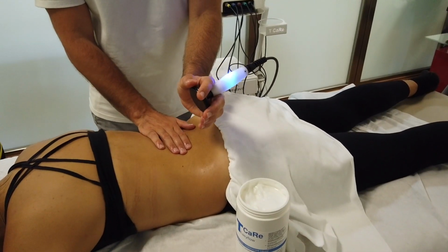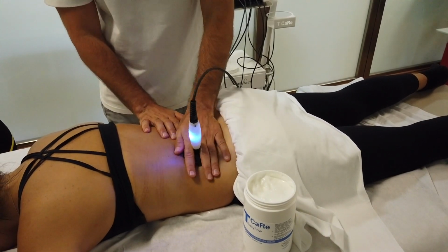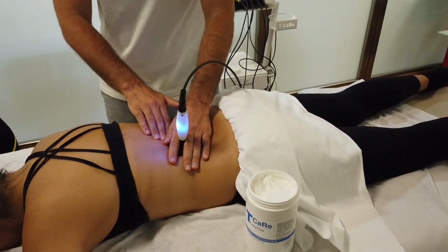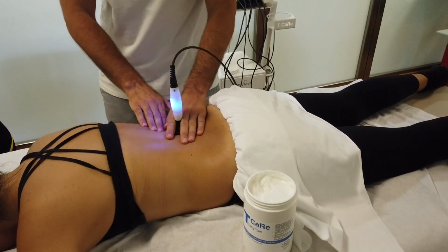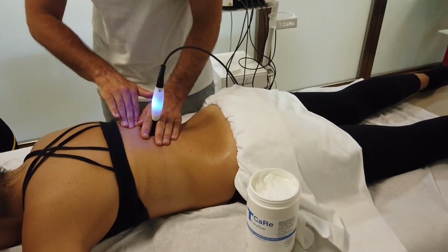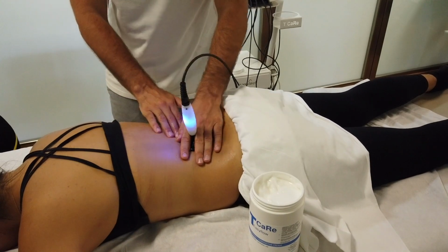I start with the capacitive electrode. Now it is in working modality because I can see the light in the piece. So I start warming up the tissues and I choose a power of 25% of total power, and the patient must have a thermal sensation of 3 out of 5 as a general indication, but then it must be customized with respect to the patient's characteristics.